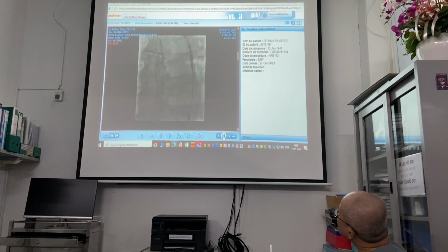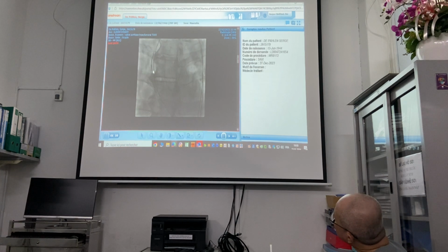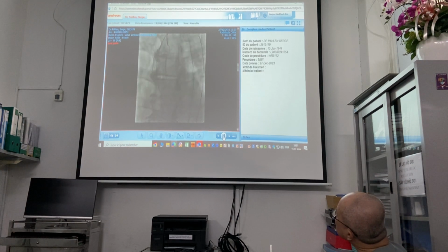I'm sorry, the internet is a bit slow. Here you see that the valve is completely embolized. The valve is here, above the valve, okay? So I take a snare to try and catch the valve. You will see. Normally you should try to snare this. There are two buttons, one there, but I could not reach it. I just have a little bit here, and then I just pull up the valve a little bit. And you see now the valve is much higher, you see?